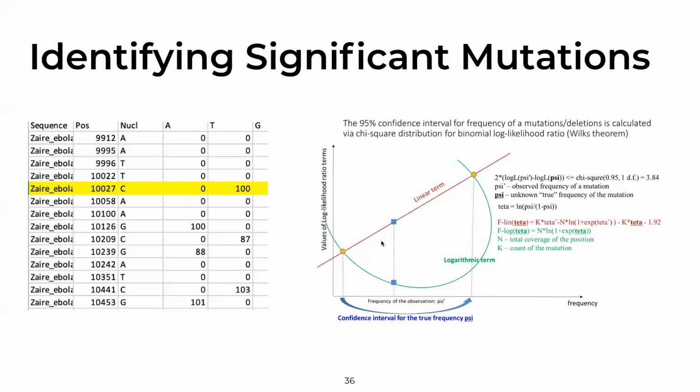A gene that has 1,000 nucleotides, that has 20,000 nucleotides, how many nucleotides does it have, right? What is the probability of finding a single variant in that length of a gene? And then looking indeed at depth, but not only a depth in that particular point, but also depth across that gene or across that region that you're looking at. And that's why there's a complexity to these algorithms that essentially produce the mutations that are ready for annotation, right?